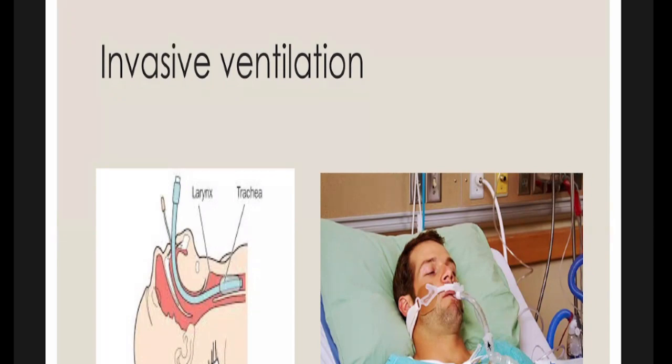It only goes into the ET tube and comes back. You can just glide it in. And this is a saline bottle hanging on the side, or sterile water, which you use for ET tube irrigation, and you can then suck the secretions out. So this is a closed suctioning system, which is very important to see even in our ICUs.